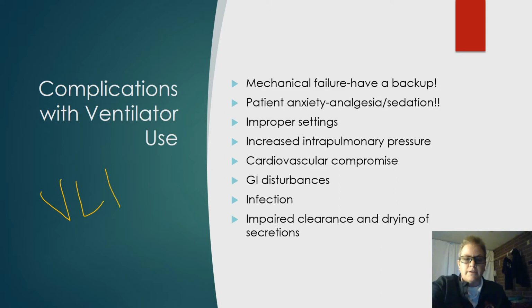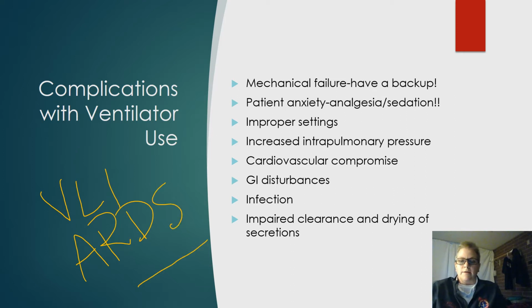And some of the biggest complications that we talk about in here are ventilator lung injury and ARDS. Massive tidal volumes can cause ventilator lung injury, causes the inflammatory process to happen, and then they've got fluids just pounding in on the alveoli, and all of the sequelae that happens with that is just not a good thing. So we do not want to produce ventilator lung injury and ARDS with the strategies and the vent settings that we use.